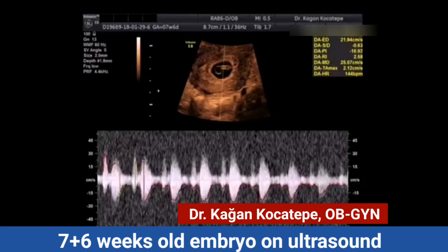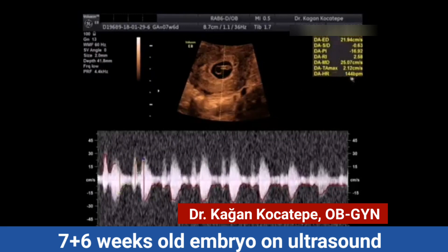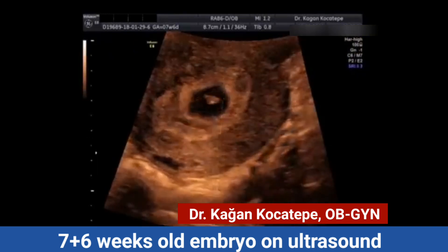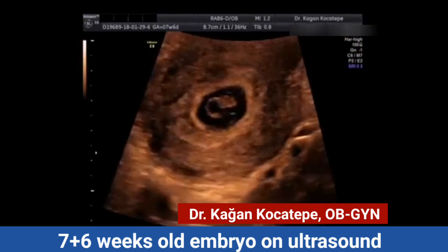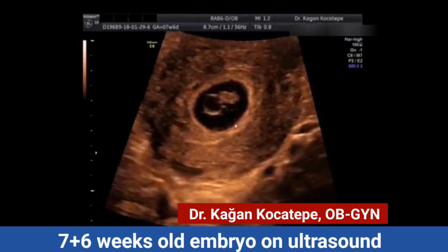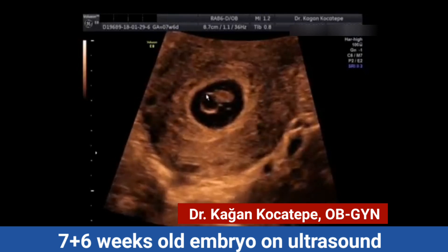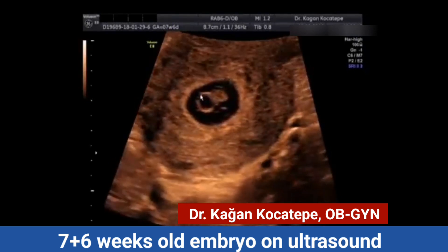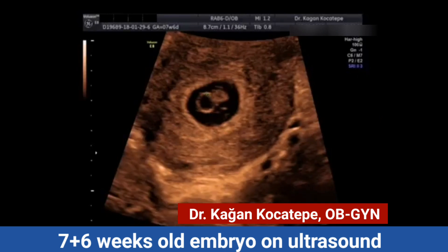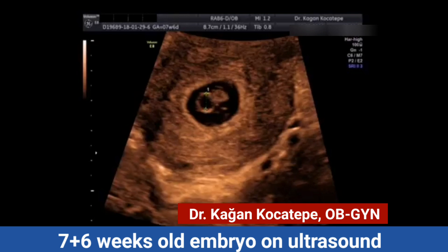The heartbeat is about 145 bpm. A range of 120 to 180 would be acceptable at this stage of gestation. Here you can see the contour of the gestational sac, and inside it the yolk sac, which is adjacent to the baby.